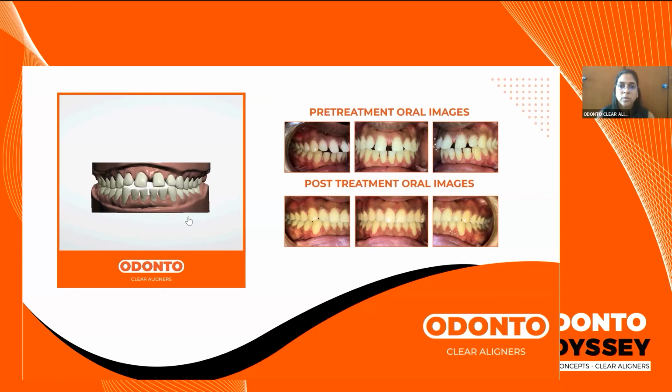Rotation also requires permanent retention. If there are anterior rotations, depending on the severity of it, you can go in for a retainer. As orthodontists, we always advise that one should go in for dual retention. If that is not the case, then we can always use just your clear aligner, which will have no attachments on it. It will be a plain retainer, plain clear aligner, which is to be used as a retainer. So premolar rotations, once corrected and once the bite is proper, the chances for relapse are much lower.